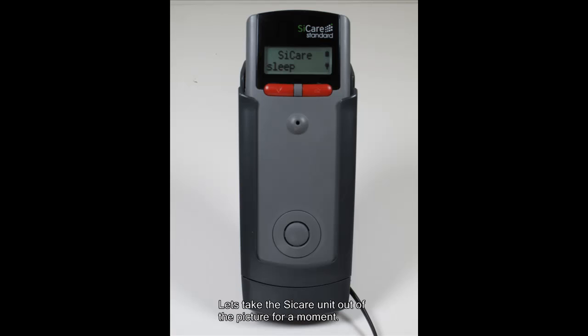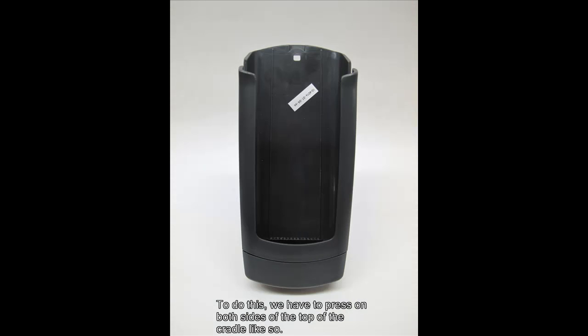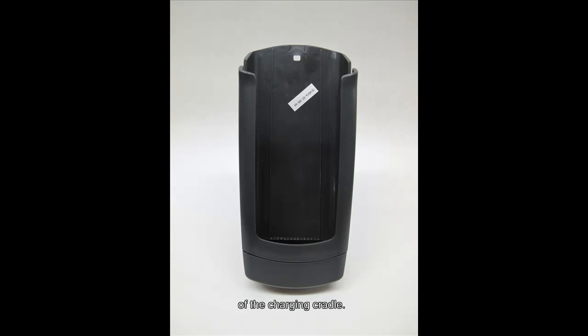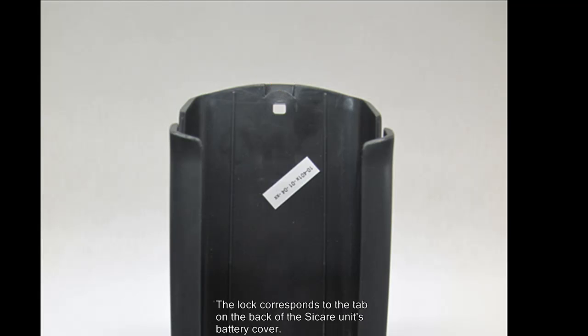Let's take the Sicare unit out of the picture for a moment. To do this we have to press on both sides at the top of the cradle like so. For a better view of where you need to press on the cradle, here it is without the Sicare unit in it. Now that the Sicare is out of the way, let's take a look at the front of the charging cradle. At the top of the cradle we see the lock that holds the Sicare into the cradle. The lock corresponds to the tab on the back of the Sicare unit's battery cover.